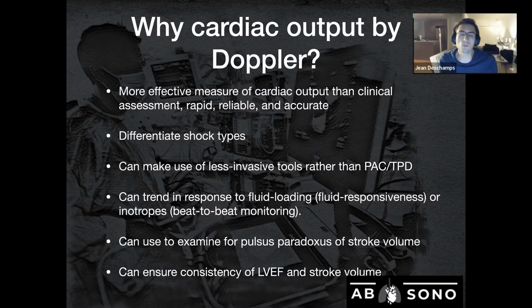Yeah, I totally agree. And one of the things people will say is, if I put in a pulmonary artery catheter, then I have much more ease getting my numbers and might get better numbers. The thing is, a PA catheter has the same type of learning curve. If you don't know how to use the numbers, you're going to get into trouble. And I would argue that a pulmonary artery catheter, if you use it with all the values involved, is probably a bit more of a learning curve than getting a VTI done and using it, because cardiac output, the actual number you get, means a lot more to most people than cardiac output, SVR, and so on in the context of a patient clinically assessed.